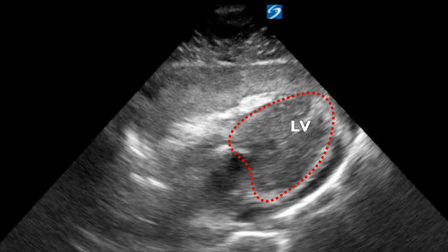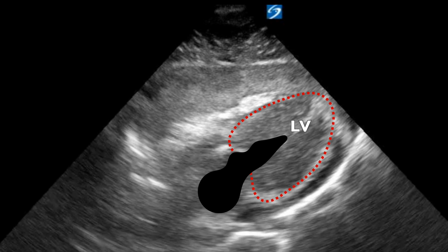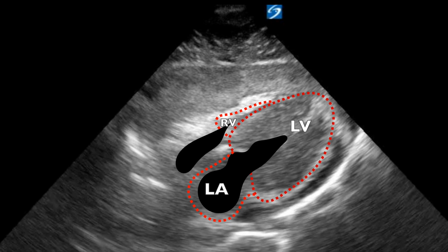It's a little bit hard to pick out, but we can see the left ventricle and the anechoic space within its chamber. This heart is not beating, which is what makes this very difficult — the providers were fanning trying to discern what's going on. Watch for that area in the video to see where the left atrium and left ventricle chambers are. Once we know where those are, we can identify the other ventricles. The right ventricle here is really small and collapsed, with the atria just above it and some fluid in that chamber.